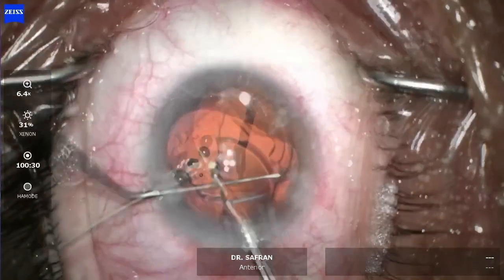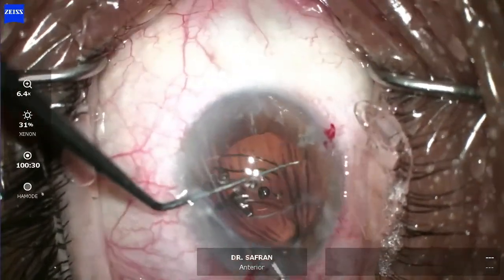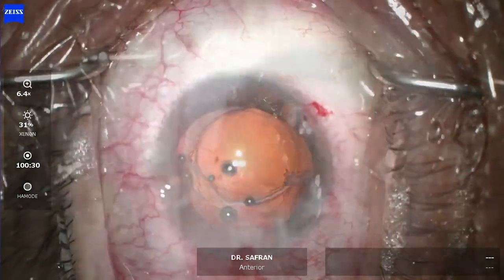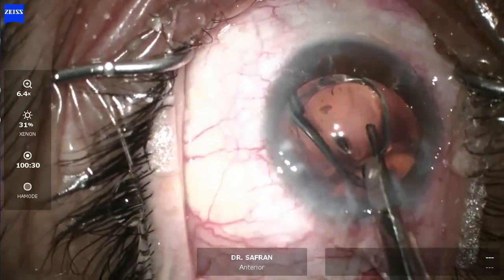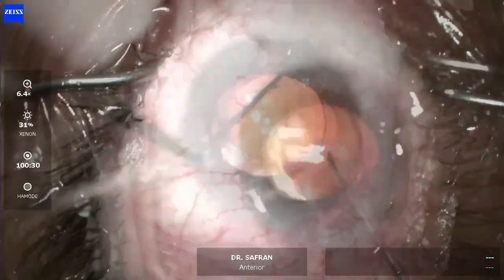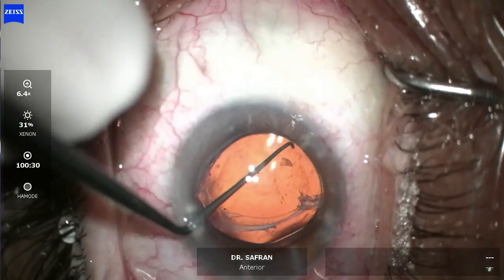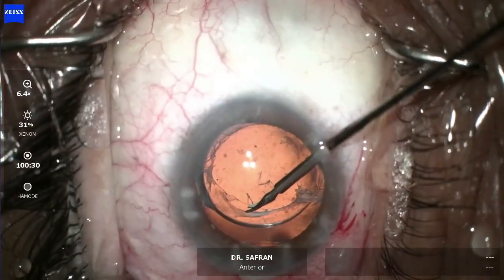We cut this soft lens in two and take it out in two pieces. Once removed, I dilate the capsular bag with viscoelastic and place a single-piece acrylic lens. I chose this lens because it has zero spherical aberration, and slight decentration within the bag won't affect vision quality as it would with an extended-depth-of-focus lens like the Raynor.